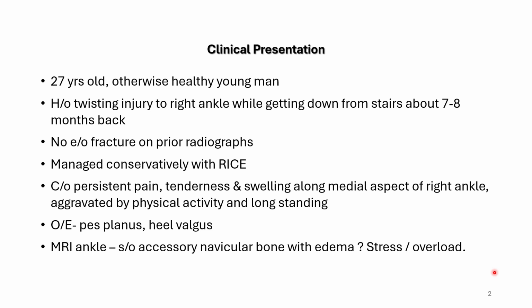On examination, there was some mild swelling, tenderness along the medial aspect of the ankle as well as pes planus and heel valgus deformity. He visited many orthopedic surgeons. Finally, MRI ankle was advised, which revealed accessory navicular bone with edema, query due to stress or overload.